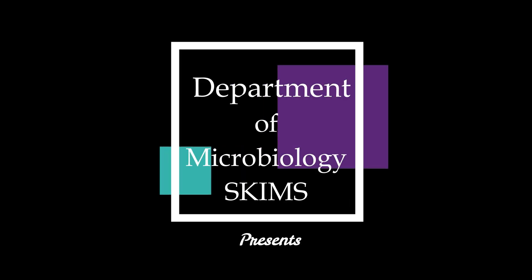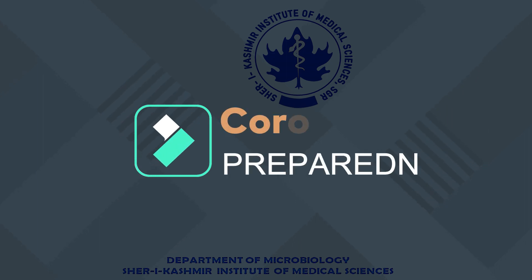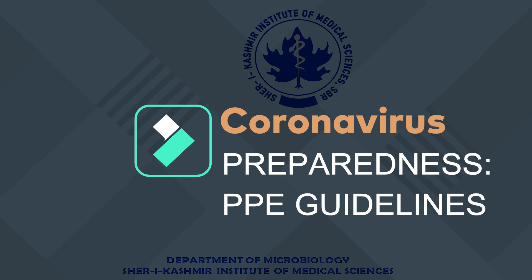Welcome to the Department of Microbiology, Sherry Kashmir Institute of Medical Sciences, Soura. In this video, we are going to demonstrate the use of personal protective equipment, or PPEs, for healthcare providers. We will demonstrate the stepwise donning and doffing of PPE during sample collection or while attending a highly infectious patient in the isolation ward.